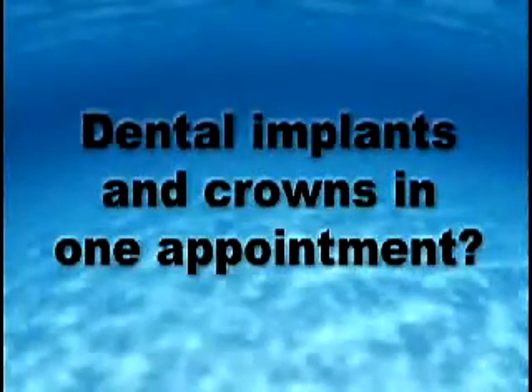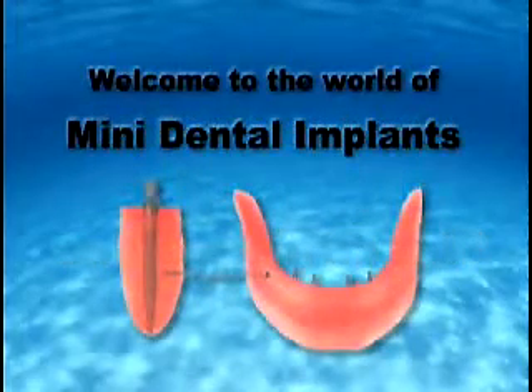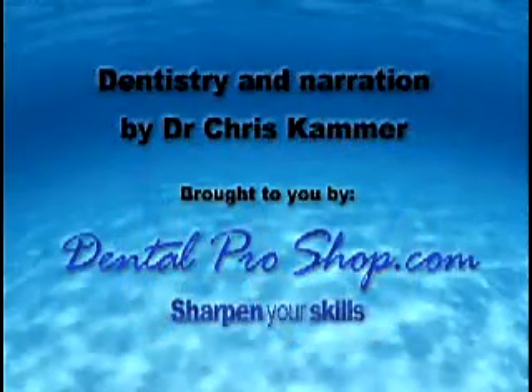You're about to see dental implants and crowns for your front teeth all done in one appointment. This three-minute video will open your eyes to a new procedure that will change dental practices and patients' lives forever.